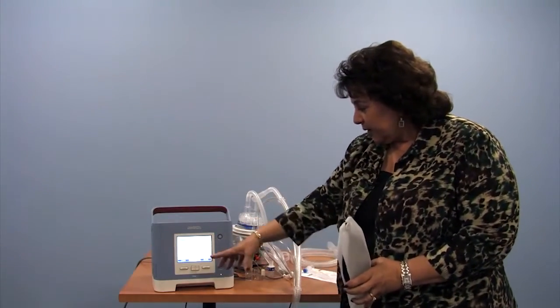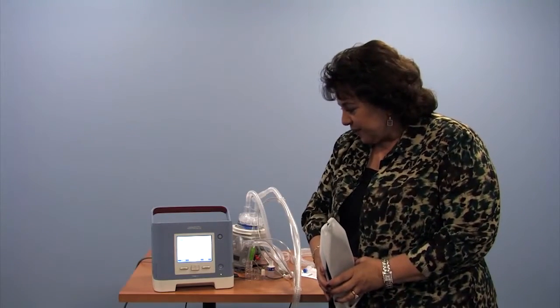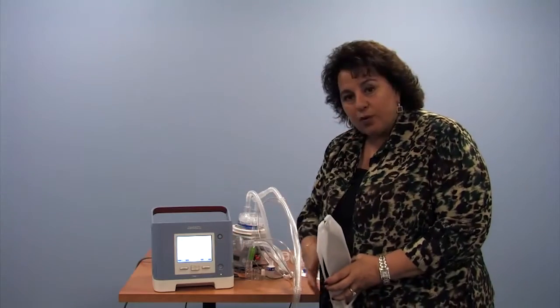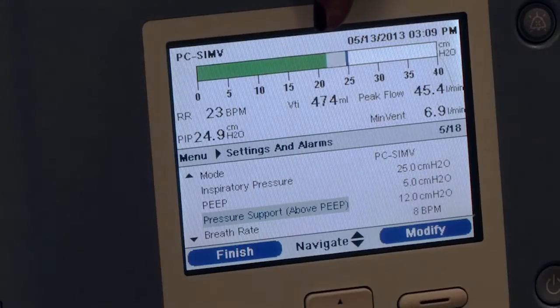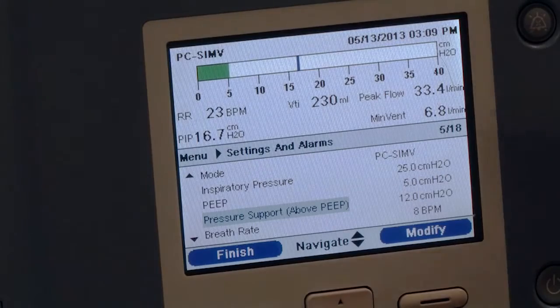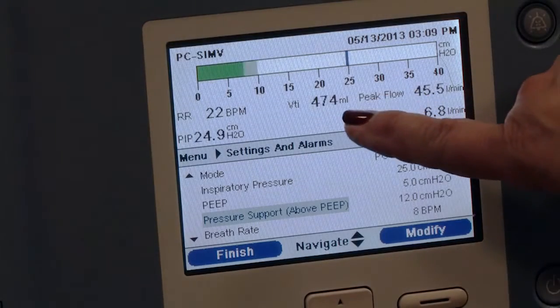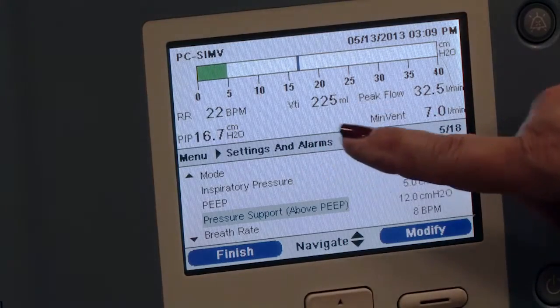And you'll see that the large ones, the mandatory breaths that go up to 25 and down to 5, measure over 400 cc's of air, but the pressure support breaths, which are up to 17 and down to 5, are less pressure and therefore smaller, measuring in the 200 range. So we see some breaths that are 400, some breaths that are 200.